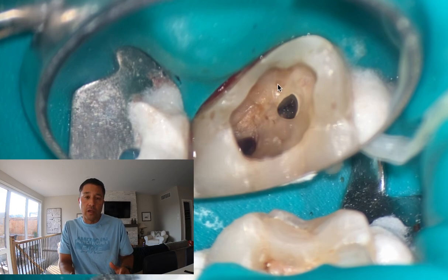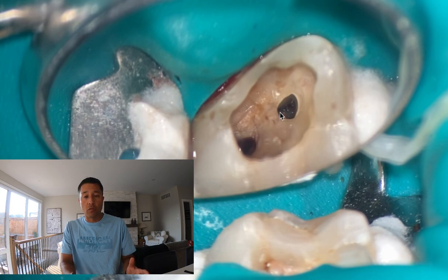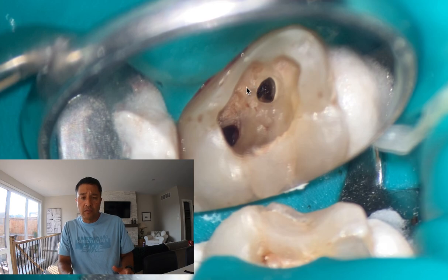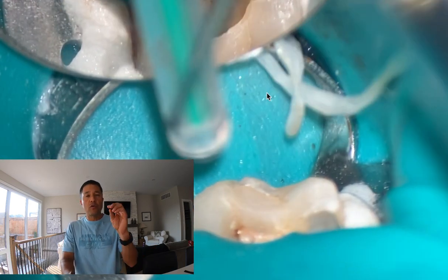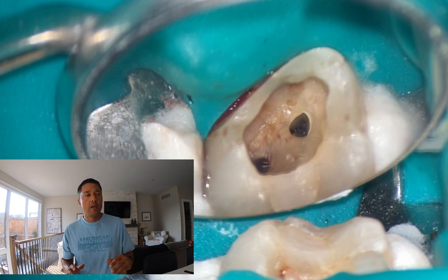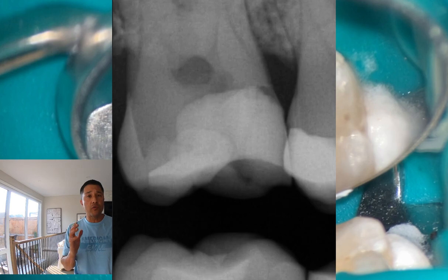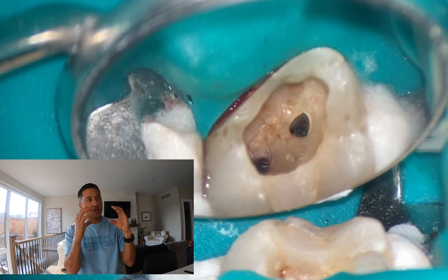The other thing I'm looking at is the level of the restoration — it's not that deep, it's not a large restoration. On the radiograph it looked a little more deep, but it looks fine here. Totally restorable. This is the gingival aspect of the restoration, so it's actually in line with where the access holes are. Are those access holes, are those perforations? I'm kind of looking at that level and this looks actually the same. If you're in a clinic and you don't know whether you've perforated or not, this is the best time to just stop and take a radiograph. A periapical radiograph is usually the go-to for endo, but actually a bite wing — if you can get a bite wing, it's a great radiograph because it's fairly perpendicular to the occlusal table, and you can actually see where you are.